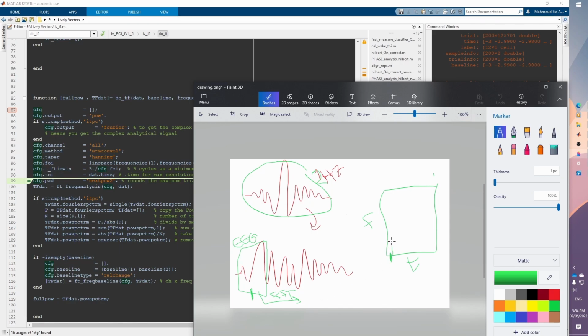Then we proceed to the next window, estimate all frequencies, and we fill that, and we slide this again, and so on until we fill in this for all time points and all frequencies.